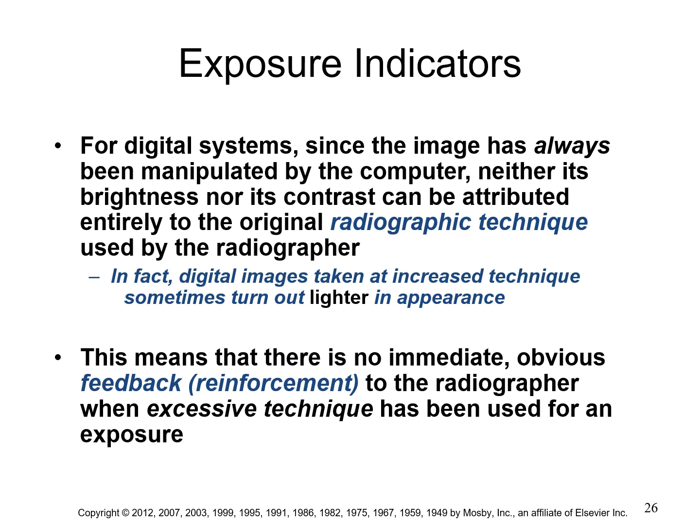Is it diagnostic? Because you can actually come in under what's recommended and still get a diagnostic image. Remember, we can go as low as 75% of what the manufacturer recommends, and we still don't see the appearance of mottle. It's when you get down to nearer to 50% of what the manufacturer recommends that you start to get a mottled appearance to your image.